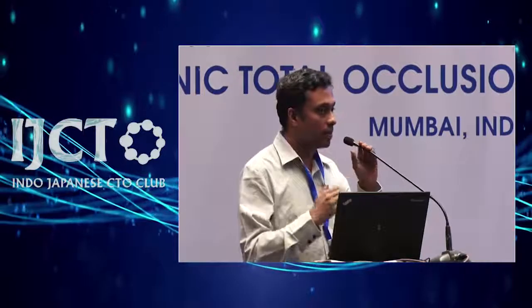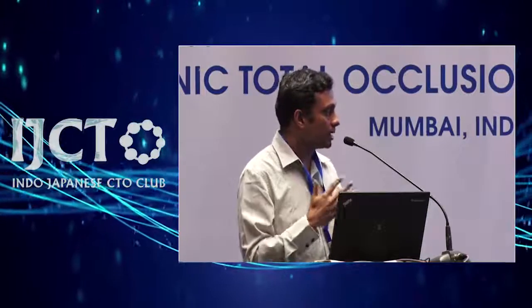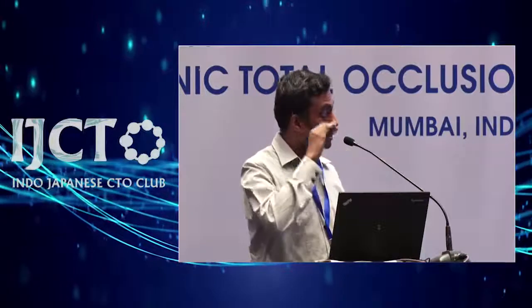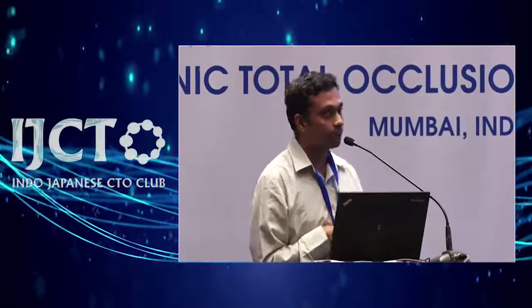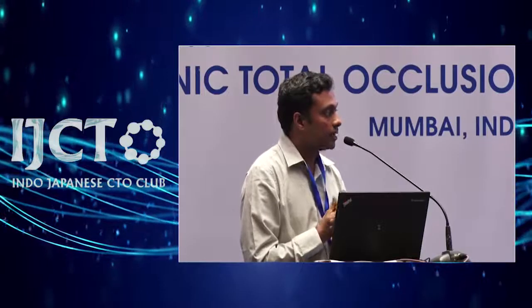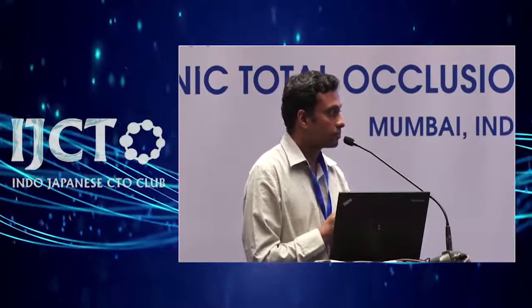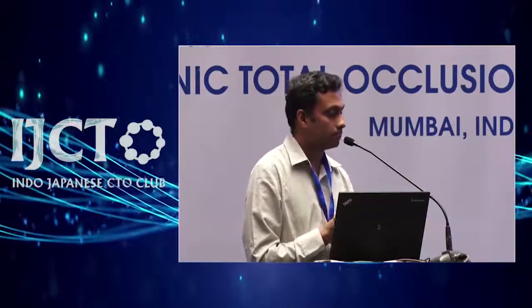So I try to keep at least one wire in the true lumen. That becomes very easy for me to do the IVUS and then go to the subintimal space and know which way to direct. In fact, I have a very low threshold of using Guideliner or Guidezilla antegradely, because then your externalization is into the guide. Sometimes your externalization may be in the aorta, then you have to use the snare technique and all becomes cumbersome. So, Guideliner does help. Yeah. Thank you. Thank you.